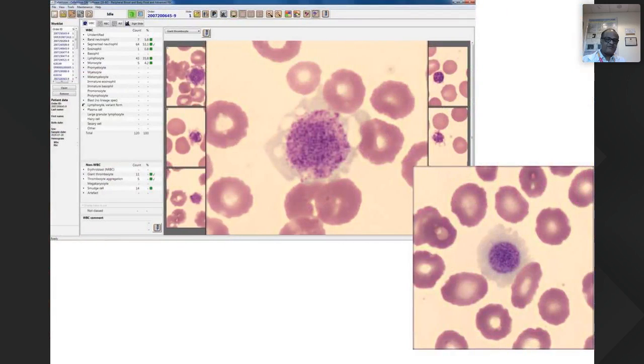And in the same patient, we were able to see the micro-megakaryocytes. See, this is a micro-megakaryocyte. A micro-megakaryocyte has got a granulated nucleus, has got a vacuolated cytoplasmic rim around it. Whereas in this, the arrow, what I'm showing is a giant platelet. It has only a cytoplasmic fragment, and does not have a nuclear component over there. But these, again, have a rim. Again, you see that you have got a micro-megakaryocyte over here.